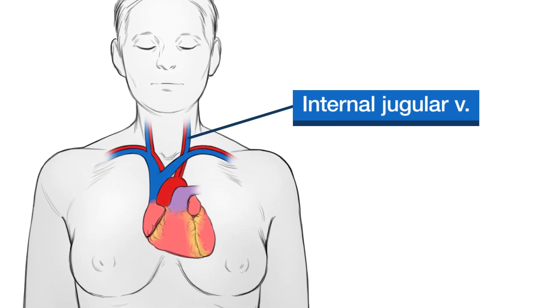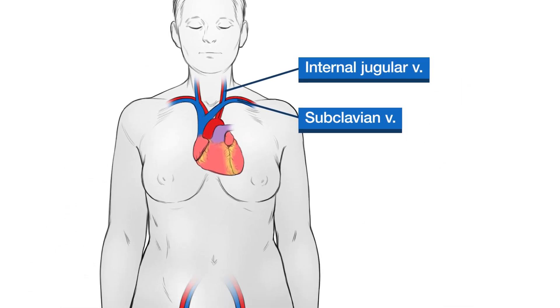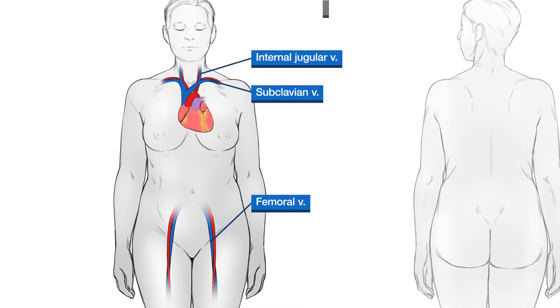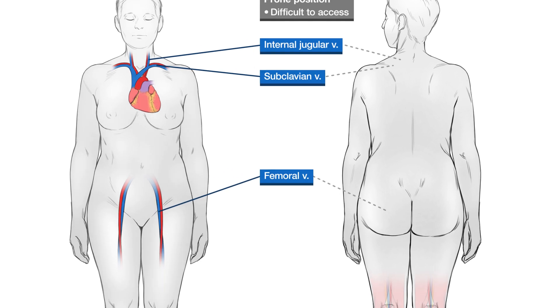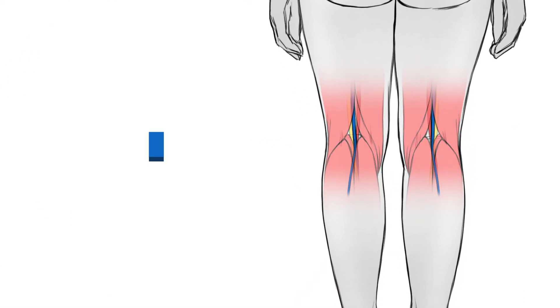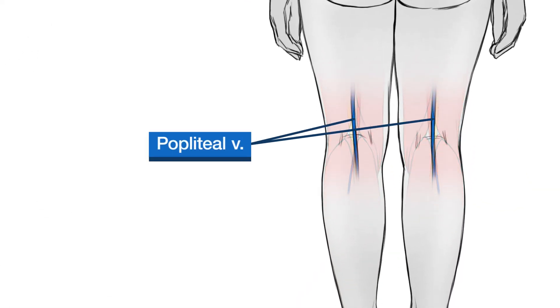Central lines are usually placed in the internal jugular, subclavian, or femoral vein. In the prone position, these sites are difficult to access. An alternative is to obtain IV access through the popliteal vein. This video will demonstrate ultrasound-guided cannulation of the popliteal vein.